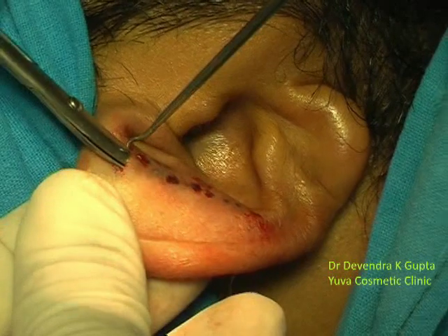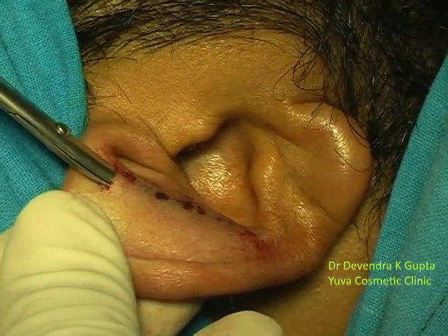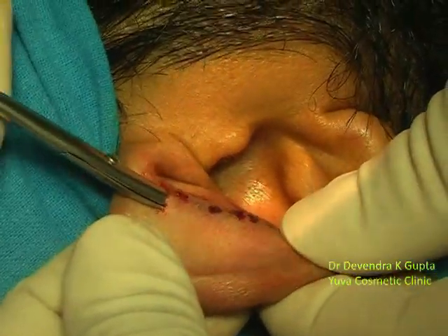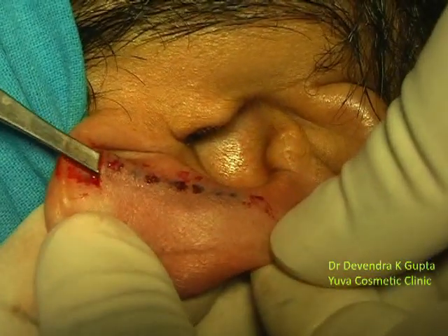Down up to the marking — you can notice here I am exactly going in the correct plane, down up to the marking.